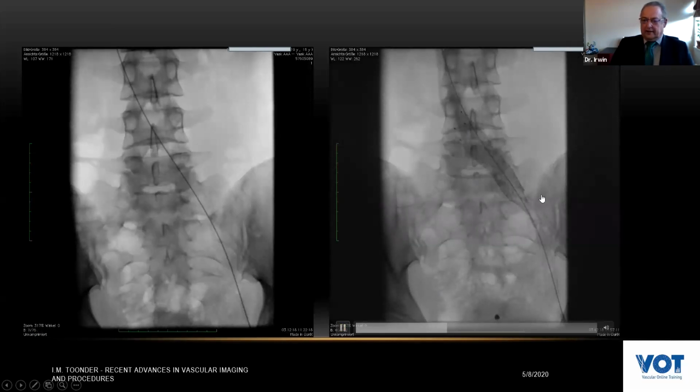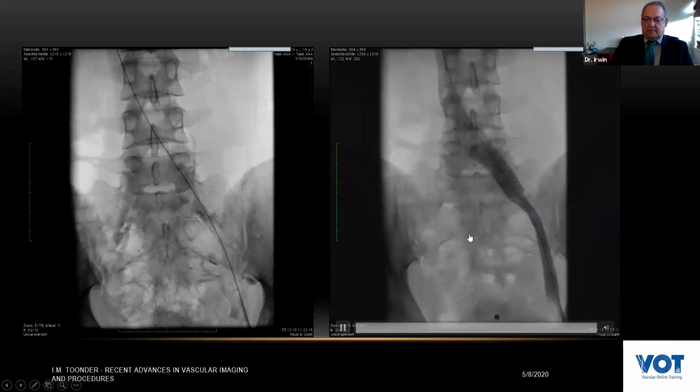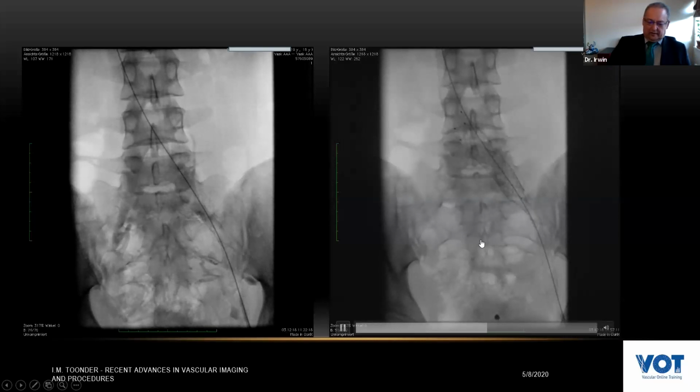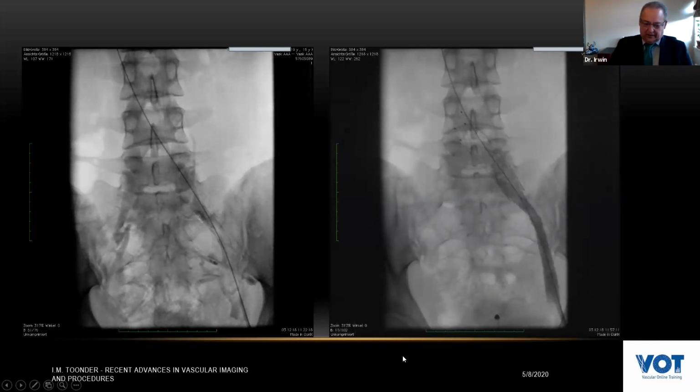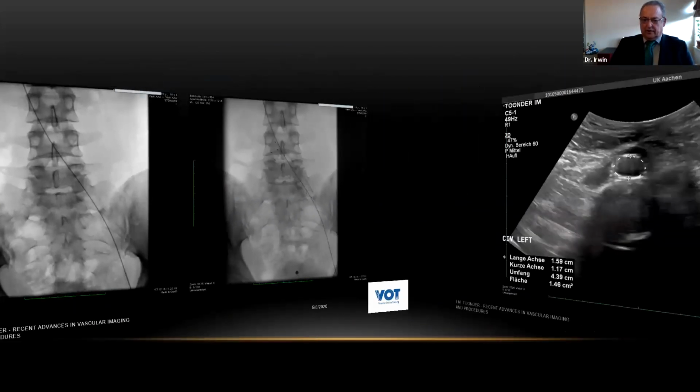And then after stenting, this is a sinus obliquus, a large stent, because based on the cross-sectional area, we don't want any stent migration, so you need to do a large stent. If you look at the lumen carefully, you can see that the lumen here is quite small compared to the stent lumen, but that's to make sure that the stent doesn't migrate, because we have had cases based on just doing supine assessment with all the other modalities, and I believe that you really need the ultrasound to confirm that your stent size is correct.